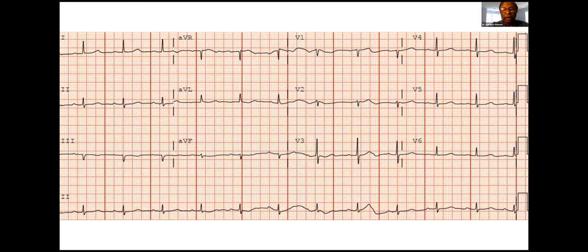If you do a 30-day heart monitor on this patient, you will see multiple places again. She will have non-conducted P waves. So stopping sotalol was a good idea because with renal impairment, it's almost impossible to maintain, especially in older patients. Sometimes I will give sotalol in a renal failure patient once a day or once every 48 or 72 hours. That's very cumbersome to do. But those non-conducted P waves are probably, yeah. So this patient did go with 30-day telemonitoring, and then we'll follow up in the office.